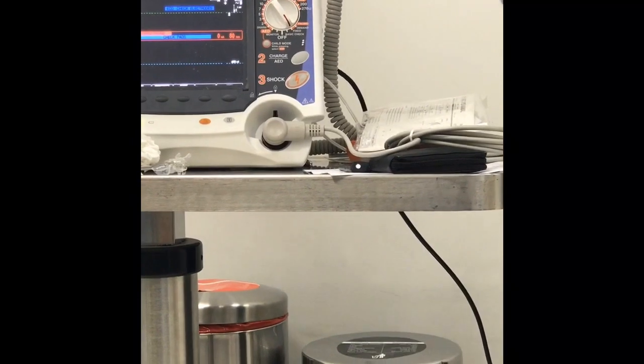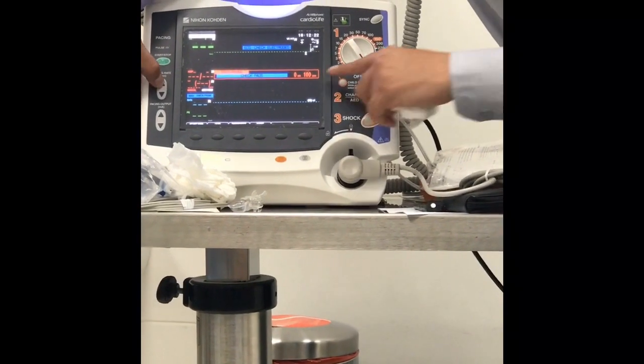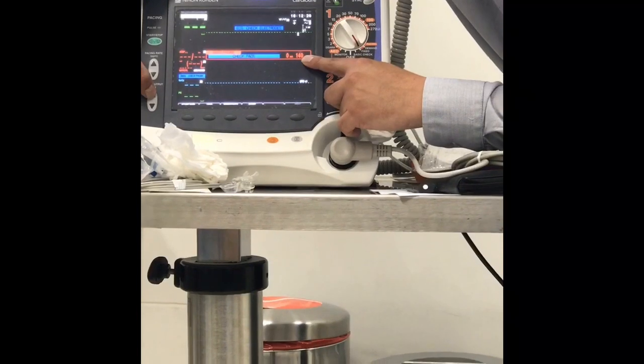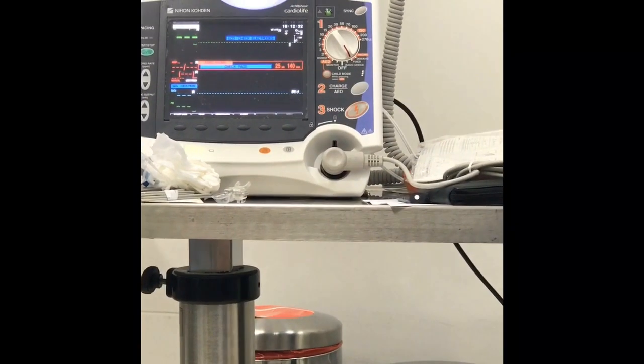This is fixed mode. Then I can adjust the milliamperes how much I want. The doctor has to adjust the value. This is the way I have to reduce and increase.